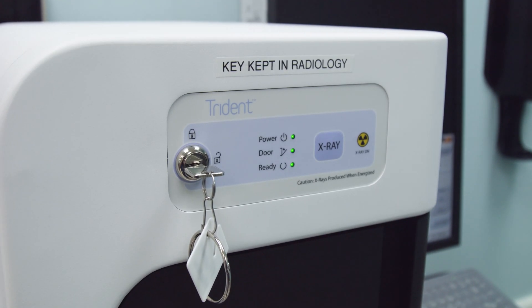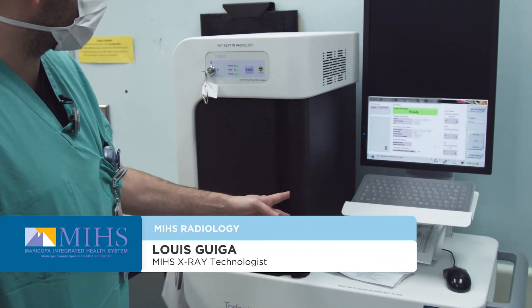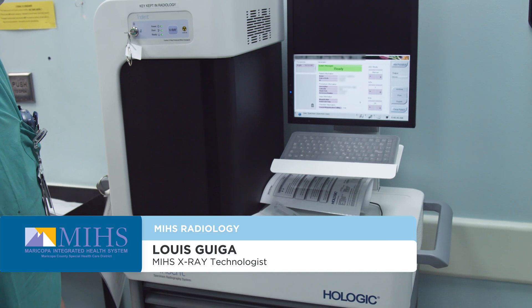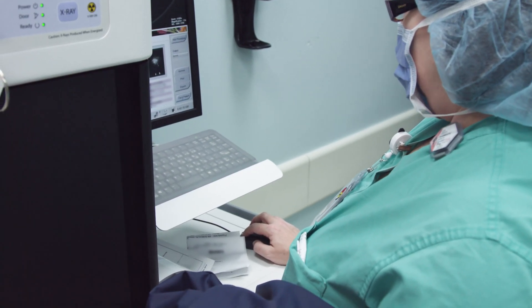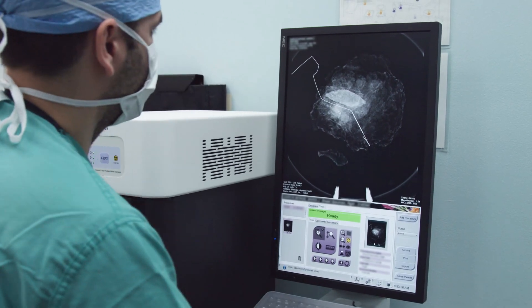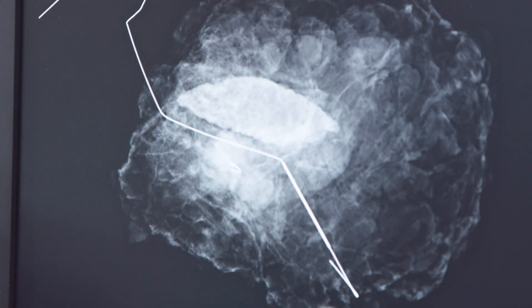We have the Hologic Trident Breast Specimen Machine. We just got it around a month ago — really nice, state-of-the-art. It's probably one of the best machines out there right now. Very user-friendly and it gives us very detailed images for the breast doctors like Dr. Komenaka and radiologist Dr. Ferraro.